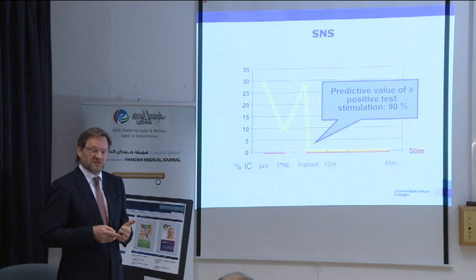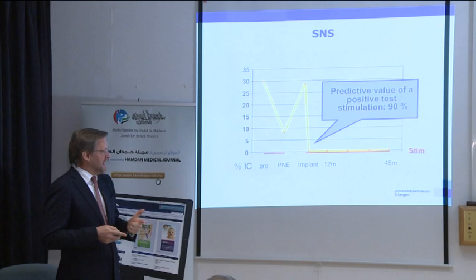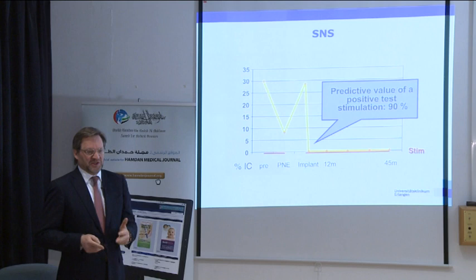First thing, the patient knows what to expect. And those patients are really eager to undergo the operation of a permanent implant. Secondly, there's a high likelihood that you as a treating physician are successful if you recommend the permanent implant, which is not always the case in surgery. So how is the outcome?